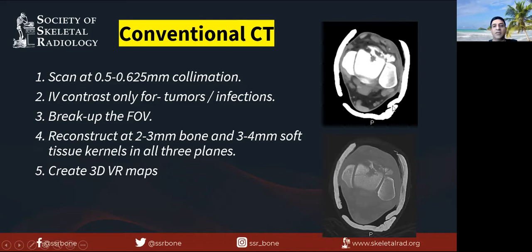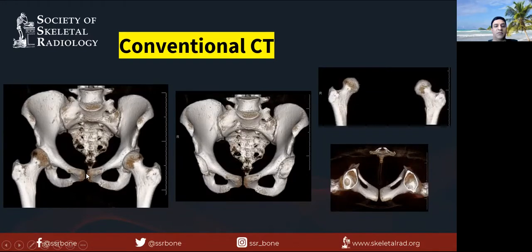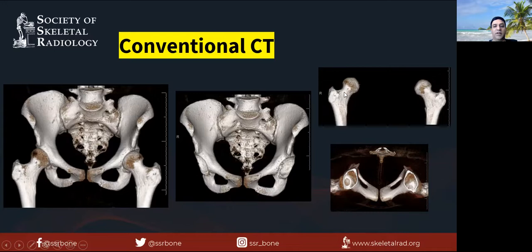Here's a scan showing the soft tissue window and the bone window — the bone window uses a high frequency algorithm. These volume rendered images provide a holistic view of the pelvis. In this case, there's a transitional vertebra with prominent mammillary processes of the sacrum. It also shows excessive overlap of the coccyx and pubic symphysis, indicating posterior pelvic tilt. These bones are segmented into acetabulum and femur to look at the normal head and neck offset and the normal shape of the acetabulum.